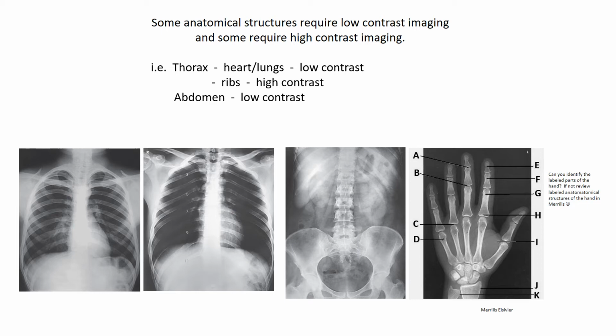And of course, we're going to see some black and some clearer areas because we need to see any gas, for example, that might be in the bowel itself, or of course, we need to see the bony structures that make up the abdomen, the spine, and the pelvic area as far as the image itself, along with the ribs and a little bit of the hips, right? Okay, we don't want to, for example, ever clip the symphysis pubis on our KUB.